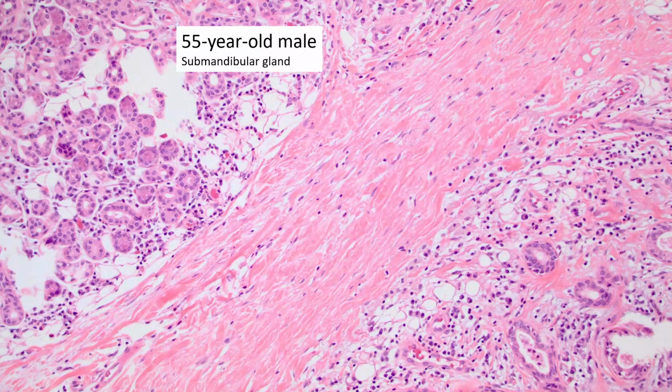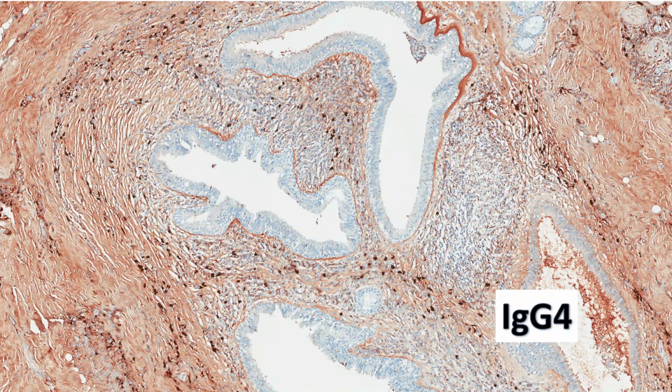But first, what are the differences between chronic sialadenitis and IgG4-related sialadenitis? It is by far and away the most common mimic. And I think the key is, one, it tends to be less inflamed, but what is less to you is maybe more to me. Look in the interlobular stroma. It looks acellular. What is missing are the inflammatory cells, and that is not the case in IgG4-related disease. Remember, the classic feature of IgG4-related disease is that inflamed stroma.